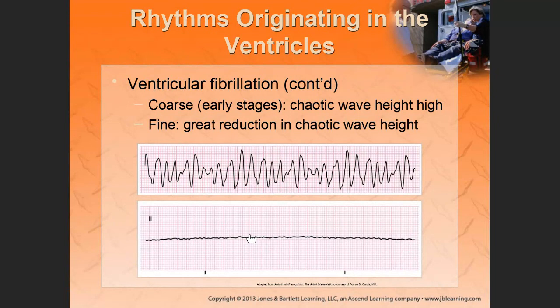Two, then check to see if your electrodes are properly attached to the patient. And then switch your lead. So if you're on lead 2, switch it to lead 3 to see if you see the same thing, and you can also turn up the gain.